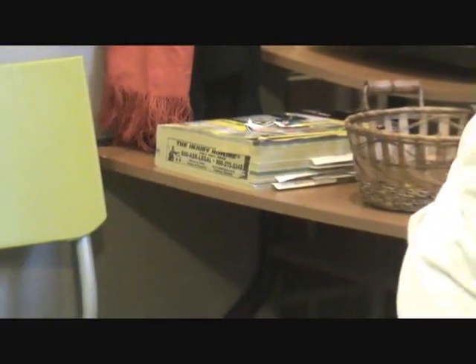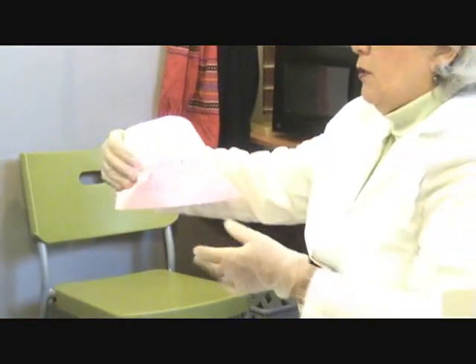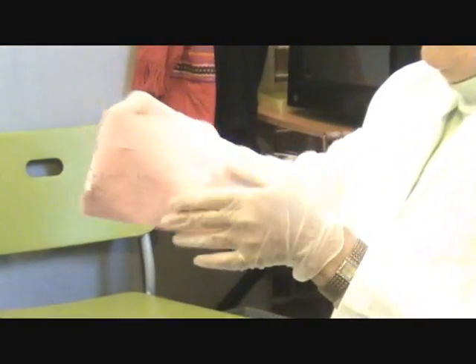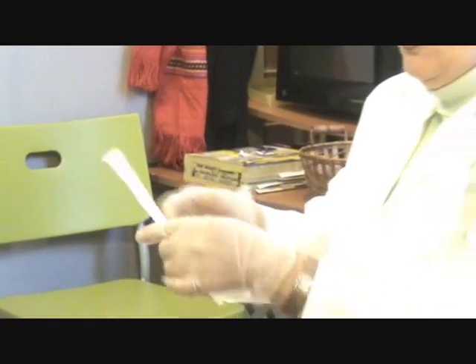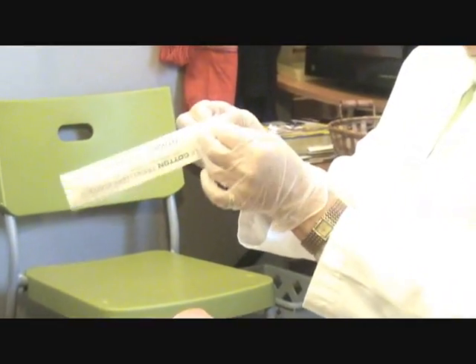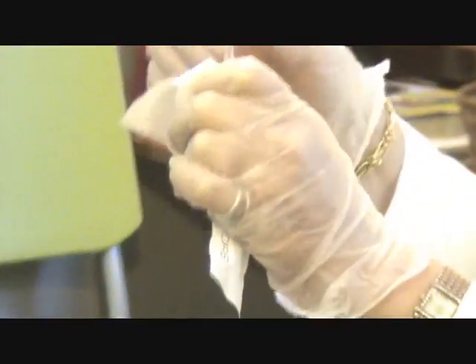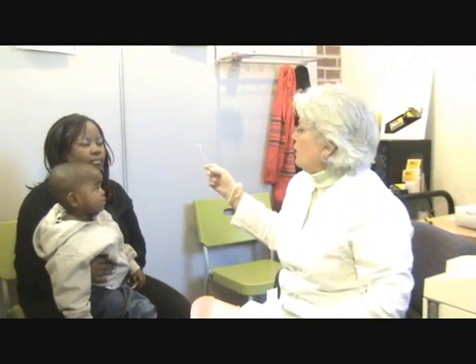I'm going to take your mommy's mouth swabs, so I'm going to open this envelope. This is color coded pink — it says mother's name on it. Here are the mouth swabs; these are sterile mouth swabs. They're dated — you can see the date when they expire. It tells you to peel at this end, which is the end of the stick. You never want to peel at the end where the cotton is. These are cotton and they're pink sticks to match the envelope, so the samples cannot get switched very easily when you have color coding.